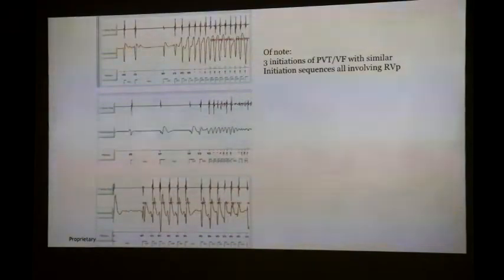So I think what you said is, if he has to be paced, we might want to think about an upgrade. In a third world country, to upgrade is not that easy. If we move the lead from where it is, it may be different. We may be pacing in a scar. I don't know. That study hasn't been done. Nobody's done that. You get the lead out of scar, possibly, but maybe, I don't know.